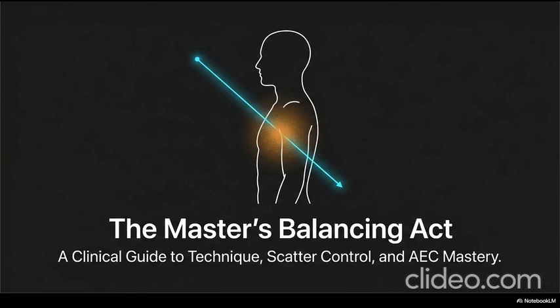Really? Yeah, it's called the air gap technique, but it introduces a severe geometric penalty, OID, or object to image receptor distance. Okay, OID. Think about making a shadow puppet on a wall with a flashlight. If you hold your hand right against the wall, the shadow is sharp and the exact size of your hand. Right. If you pull your hand away from the wall and closer to the flashlight, creating an air gap, your shadow gets huge, the edges blur, and you lose all the fine detail.